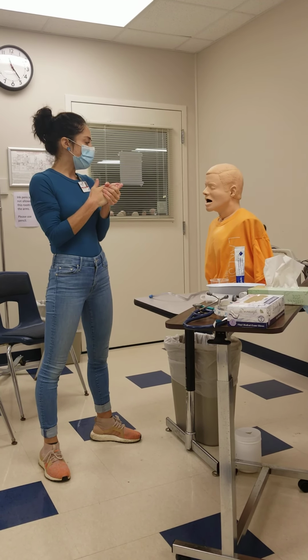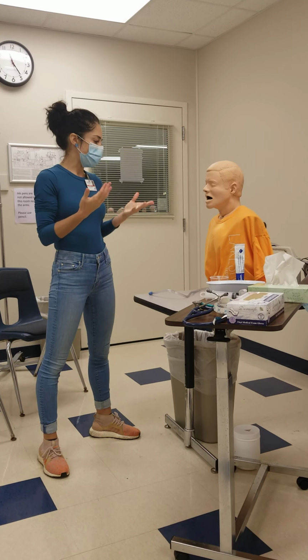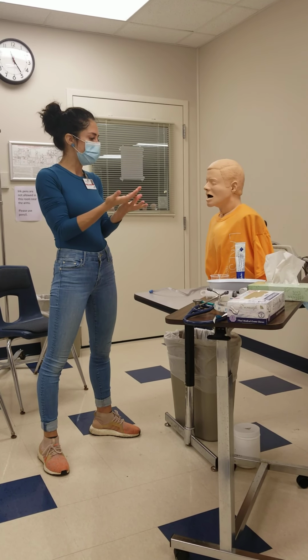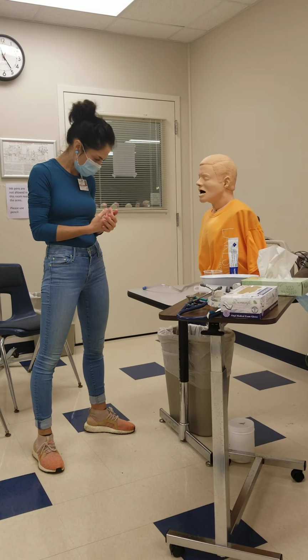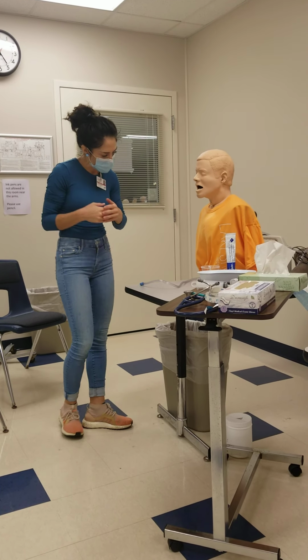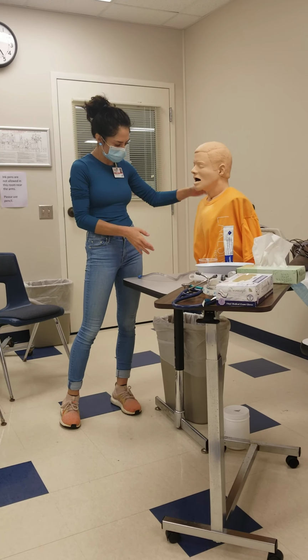So Sarah, your physician has ordered an NG tube, a nasogastric tube. That will be helping to empty out a lot of those contents of your stomach, which are making you so uncomfortable. So first I will begin by placing you in high Fowler's.